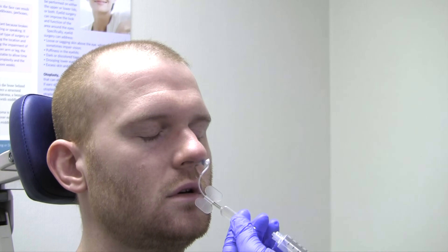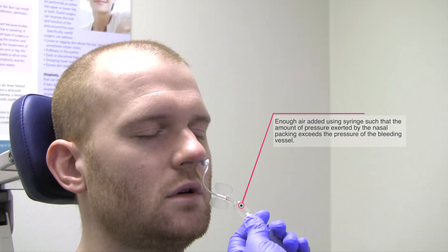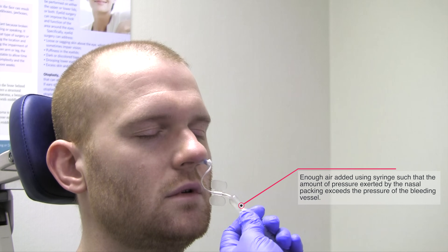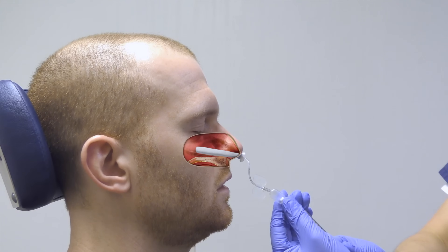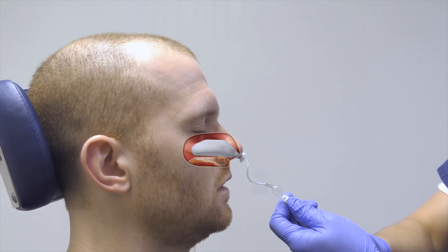Once fully inserted, a syringe is used to inflate the balloon within the nasal pack. Enough air is added such that the amount of pressure exerted by the balloon inside the nasal pack exceeds the pressure of the bleeding vessel. Here is an animation showing how the balloon inflates the nasal pack to exert pressure within the nose.